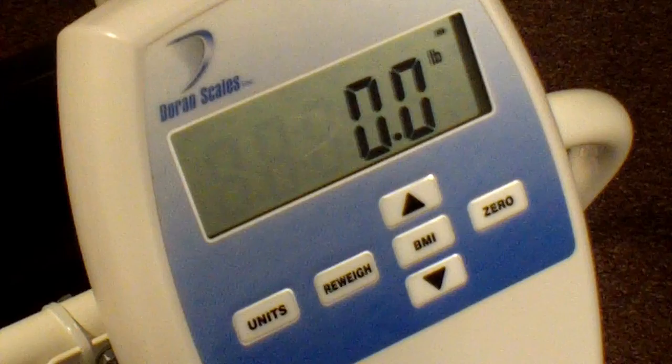The padded armrests fold up to allow patients to slide onto the scale from the bed or a wheelchair, and can be folded back down for the patient's safety. The weight results and BMI calculations are displayed on the scale's one-inch tall LCD display, with the indicator mounted on a swivel bracket at the rear of the chair.